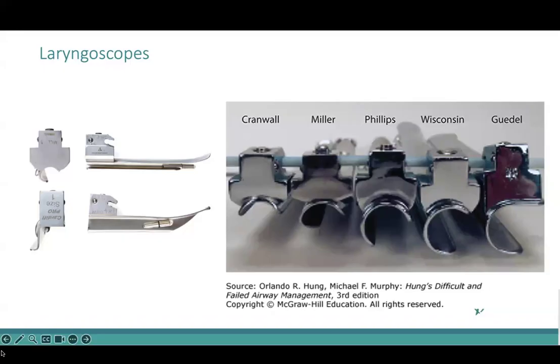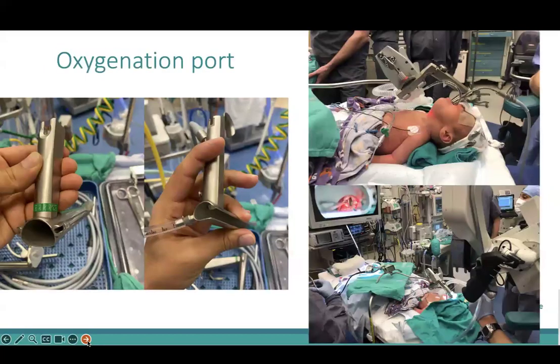and how you use them. I also specifically wanted to mention these two laryngoscopes that have an oxygenation port attached to them. This is a Lindholm laryngoscope and a Parsons laryngoscope, and they both have suspension handles as well. A suspension microlaryngoscopy setup looks exactly like this, where we're able to perform two-handed surgery using the microscope in the larynx, the glottic area, and the trachea as well.